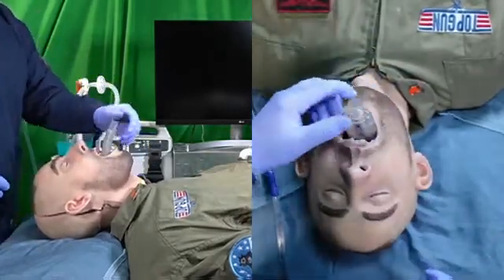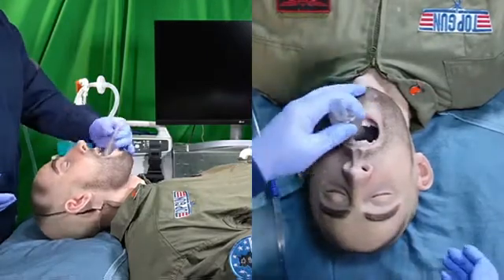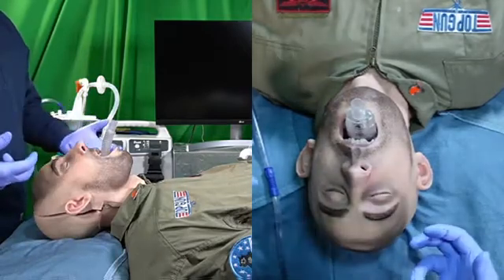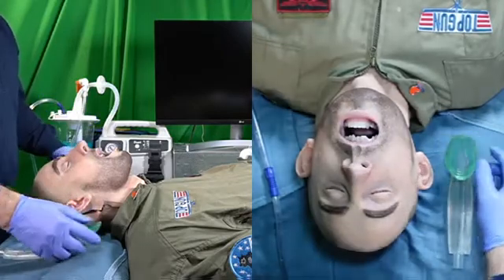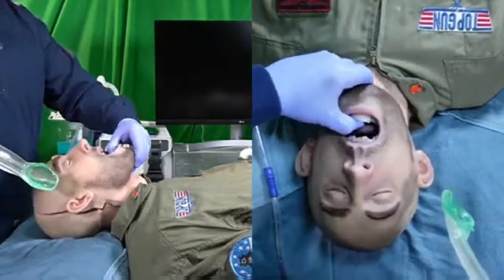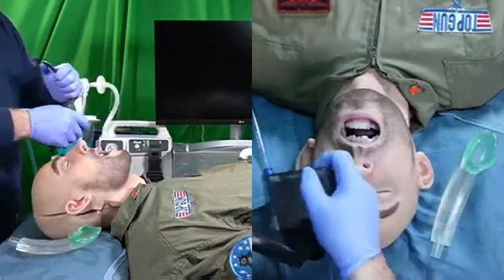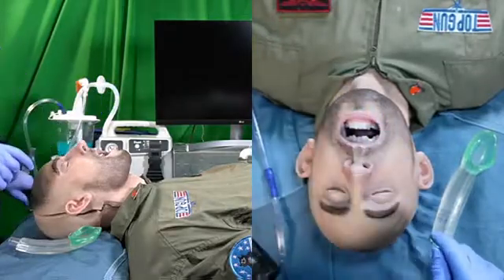This is a standard method of placement in anesthesiology where we have a fully anesthetized and relaxed patient. But this doesn't do the topic justice when we're talking about the pre-hospital use or the emergency use of this airway. If difficulty inserting the iGel is encountered on the attempt using the standard mandibular lift maneuver, a laryngoscope is permitted in most services to help place the supraglottic airway.